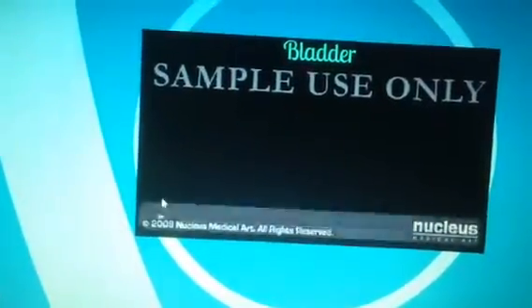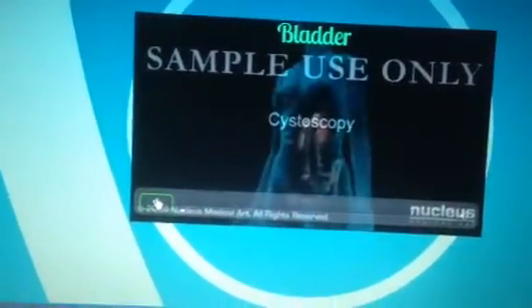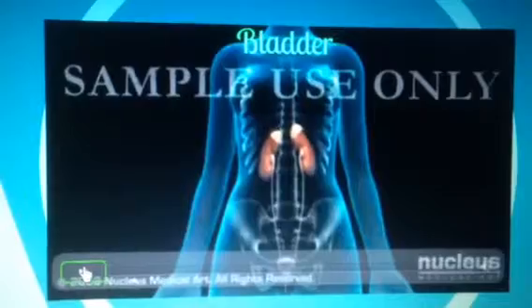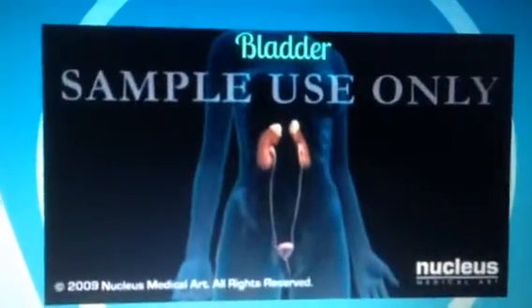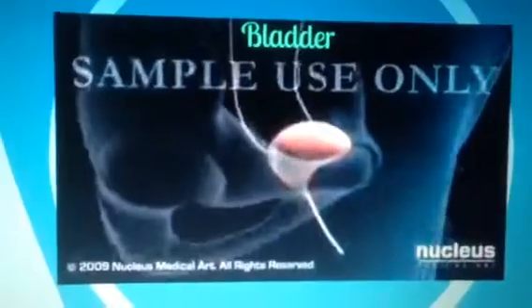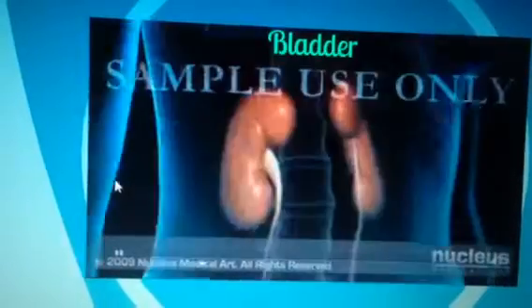Well, continue. In this other video, we can see another example, another cystoscopy of the urinary bladder. Your doctor will perform a cystoscopy to diagnose conditions of your urinary tract. Your urinary system, or urinary tract, produces urine and excretes it from the body. It includes the kidneys, ureters, bladder, and urethra. In men, the prostate gland wraps around the urethra at the base of the bladder.